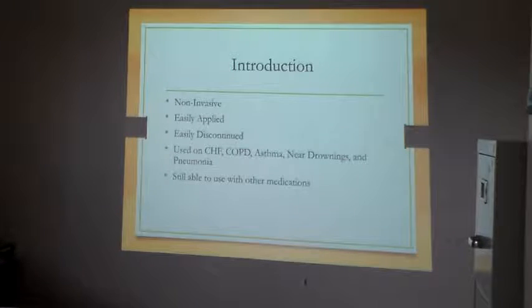So if you have the patient that's on a nebulizer, you can actually create what I like to refer to as the peace pipe. And you'll have your CPAP tubing, your nebulizer, you can use capnography in line with it, and the mask. And it's like this far away from the patient's face, what I call a peace pipe. But you have all these things in circuit and they all work together.